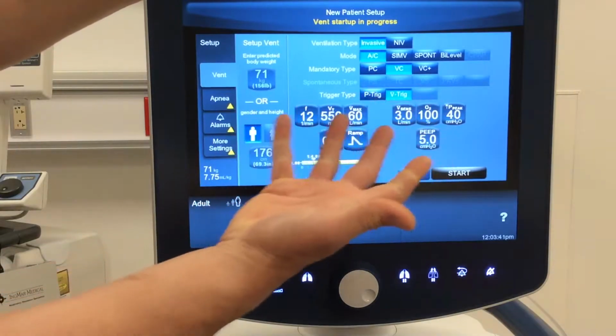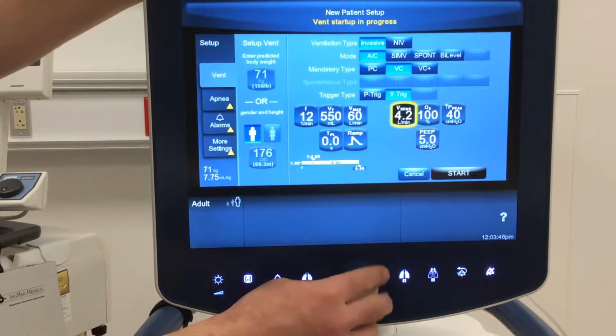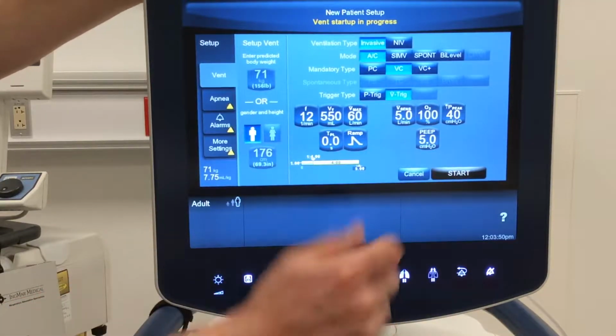So to touch, and I should have told you this, to make any manipulations, if you touch, you can turn the little wheel here, and you can lock it in place by double tapping or tapping the screen again.